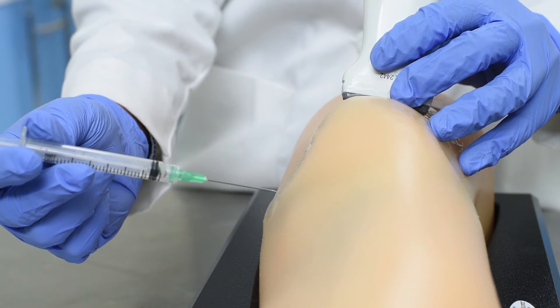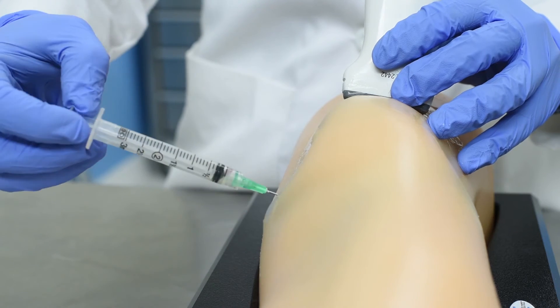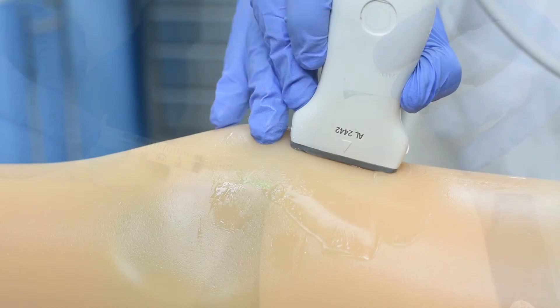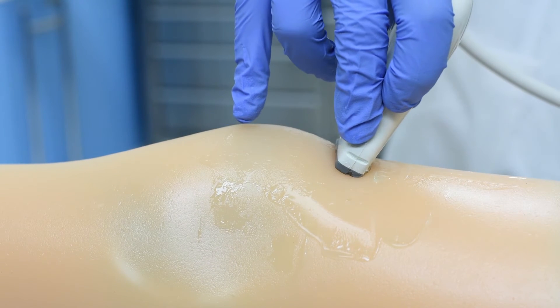With the Blue Phantom MSK knee model, gain confidence in ultrasound guided joint injection of the knee before ever performing the procedure on a human patient. When you place an ultrasound probe on the model, you'll experience excellent ultrasound image quality.